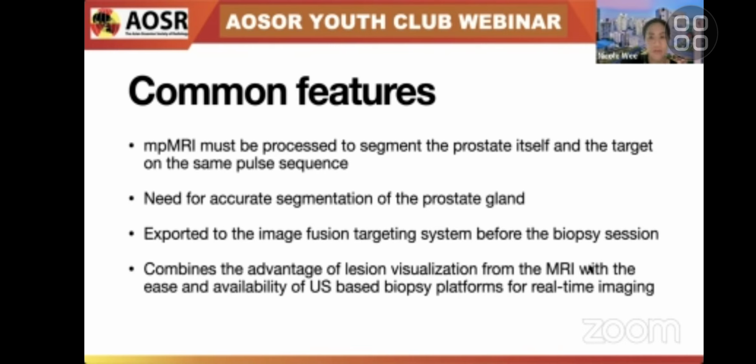Processing should be available and exported to the image fusion targeting system before the biopsy session. An expert technologist can perform the segmentation based on the annotation of the multiparametric MR by the interpreting radiologist. So both types of biopsies combine the advantage of lesion visualization from the MR with ease and availability of ultrasound-based biopsy platforms for real-time imaging.